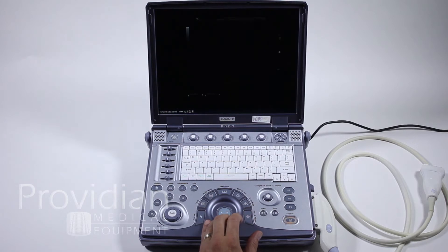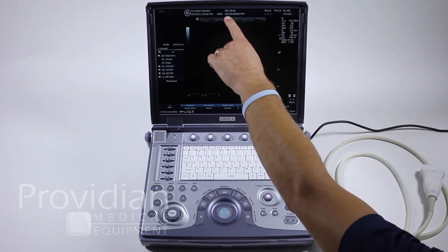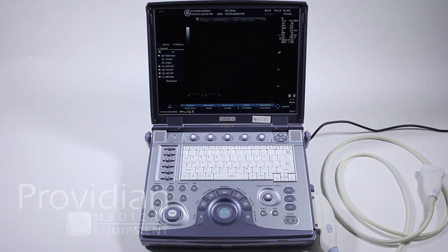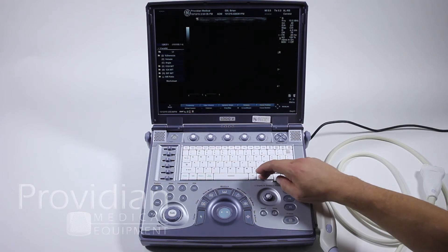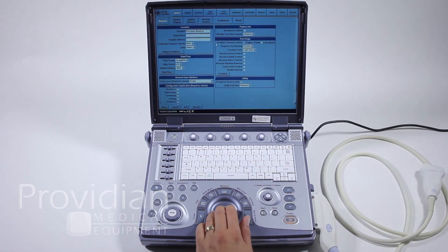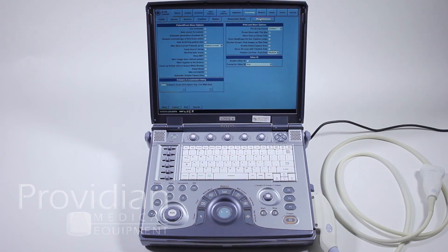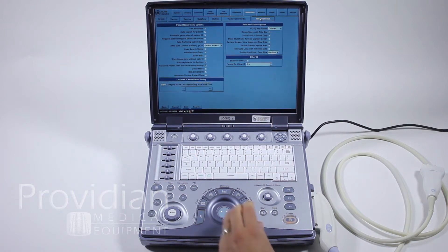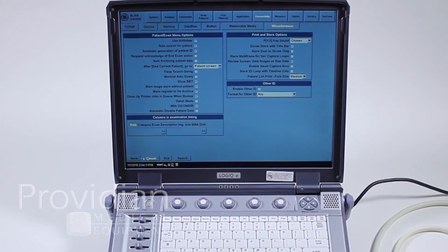I'll click exit, and now we have the patient name and patient ID at the top of the screen. Let me jump ahead in the training to the system setup screen to show you how to have it automatically generate a patient ID. Click the utility button, then connectivity, click on connectivity and miscellaneous. These aren't always intuitive — it is quite complicated and kind of hard to find everything. But right here it says automatic generation of patient ID — click that and set it, then click save and click exit.